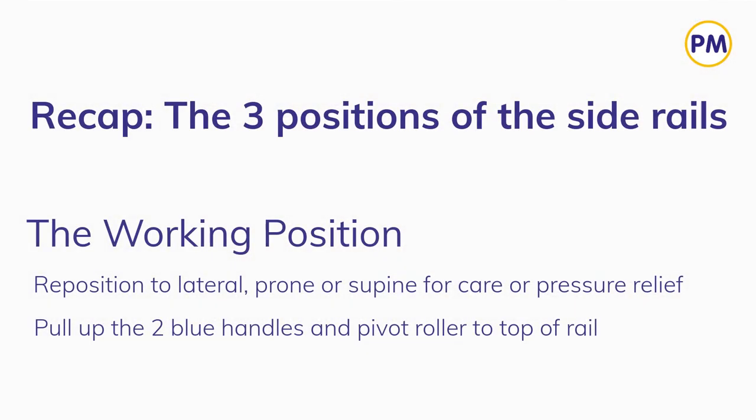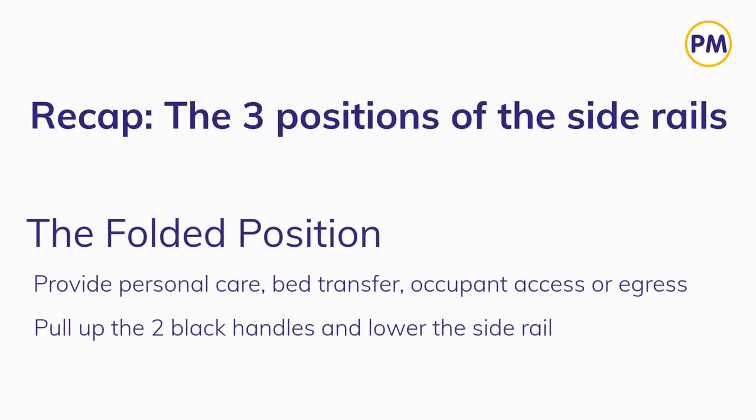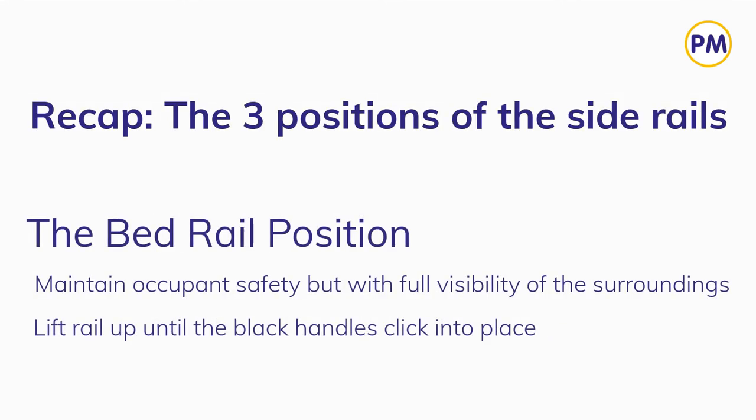So to recap: the working position enables you to reposition the occupant for care or pressure relief. The folded position enables you to draw the occupant nearer to the edge of the bed for personal care, bed transfer, or access. And the bed rail position maintains occupant safety whilst retaining full visibility of their surroundings.